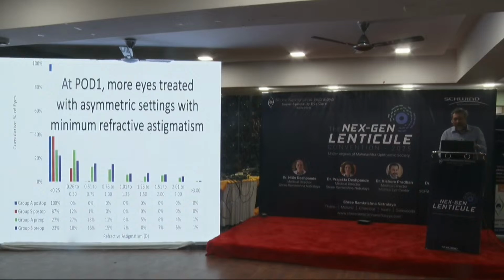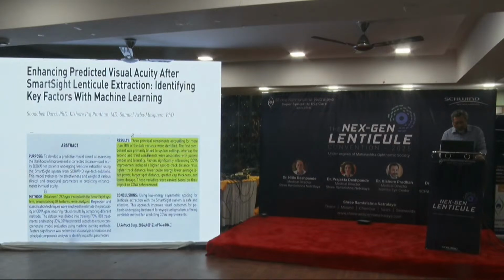And the patients are much, much happier. It used to be like, yes, I can see 20/20, doctor, but when will my vision come back? That's what the patient will always say. With LASIK, the patient says, wow, I can see everything, doctor, I can see all the fine things. But with the SMILE, we would go like, yes, doctor, I can see, but when will my vision come back? They were never happy, because that swelling is there. So if you look at that, 100% of patients within.